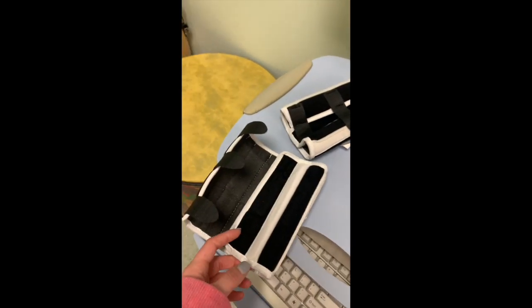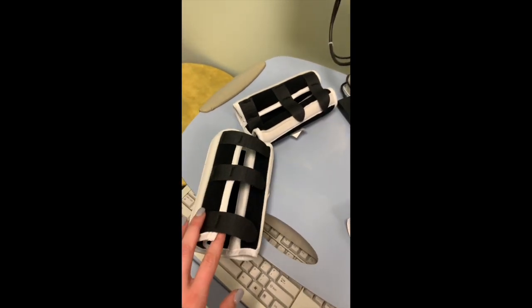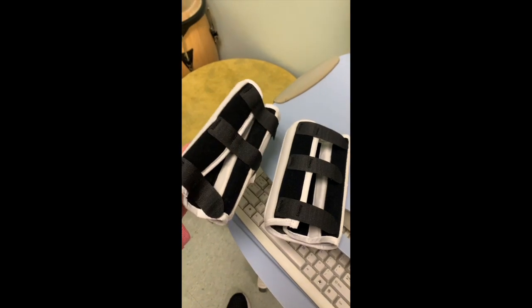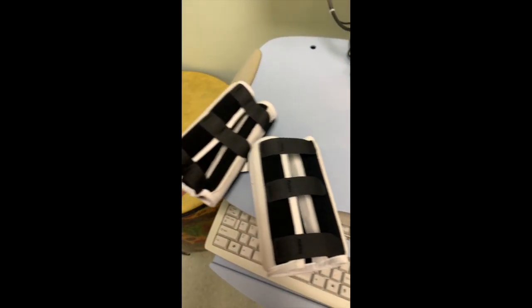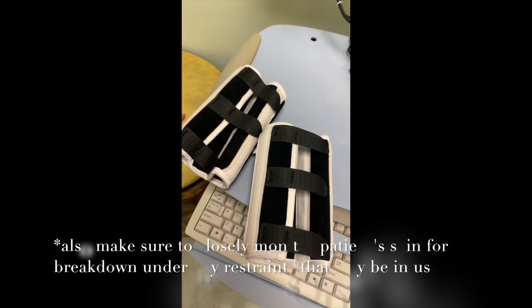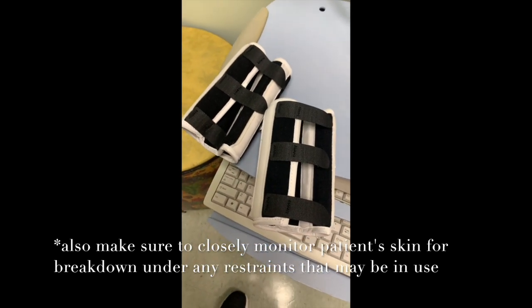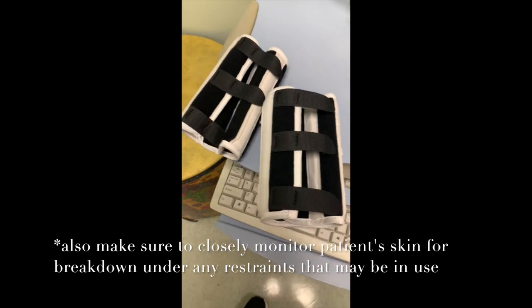These can be used both individually, if there's just one arm that's more active than another, or both together, one on each elbow. However, like I stated before, these are a restraint, so you do in fact need a doctor's order and to monitor the patient very closely while you have them in these.